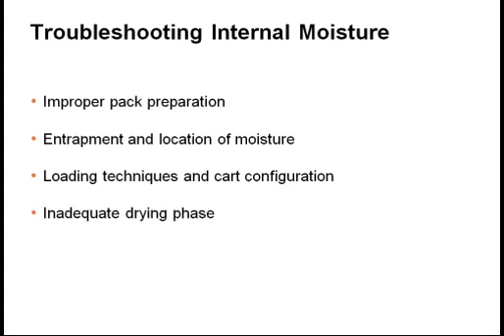In pack preparation, staff members must consider the metal mass in sets. When large concentrations of metal mass are localized in a small area, this produces a quantity of water relative to its size and density, creating too much moisture to dry properly. Metal mass should be dispersed through the trays. Larger trays may be necessary, or the need to divide larger sets into 2 trays.